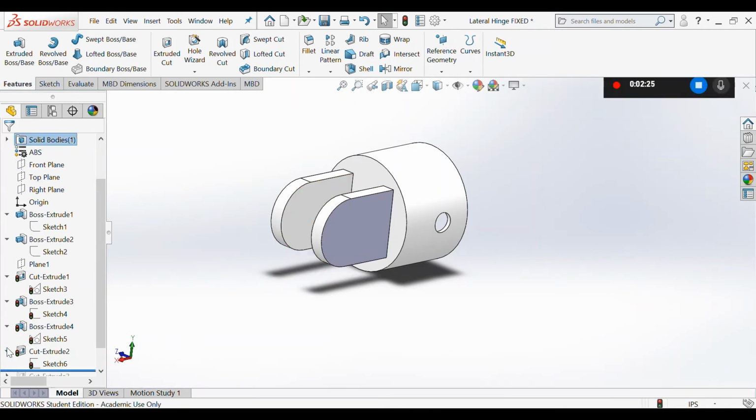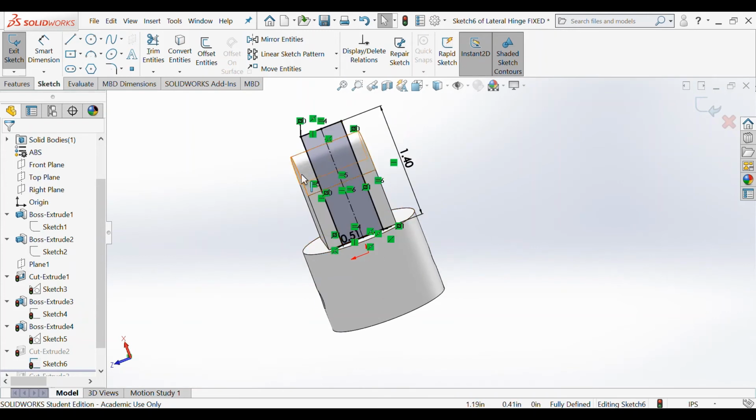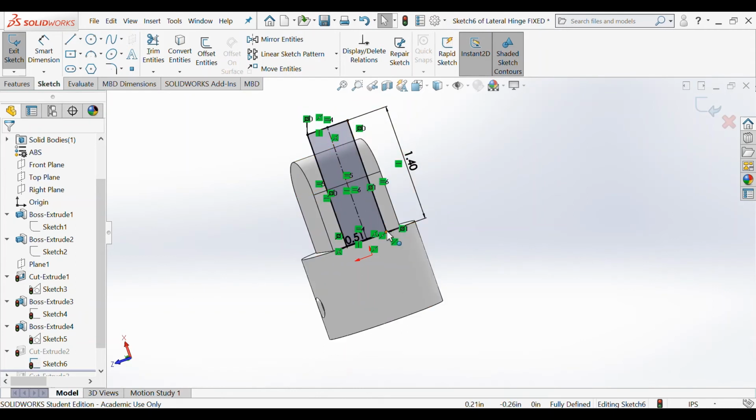Next, we created another sketch, this time on a plane coincident to this face right here. So what we did was we drew a rectangle coincident to this entity right here out, and we made it 1.4 inches tall and 0.51 inches wide. Now we centered this rectangle on this face right here, which made it fully defined.